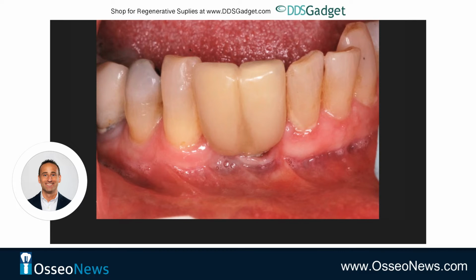And the first thing that I noticed when I looked was that the tissue quality in front of the implants was frankly very poor. You could even see that the margin was pulling away as we pulled the lip to take a look. Tissue is very thin, no keratinized tissue, almost no vestibular depth in that area. You can see the plaque accumulation. So I told the patient that I recommend a free gingival graft to correct this and hopefully be able to get rid of her symptoms.